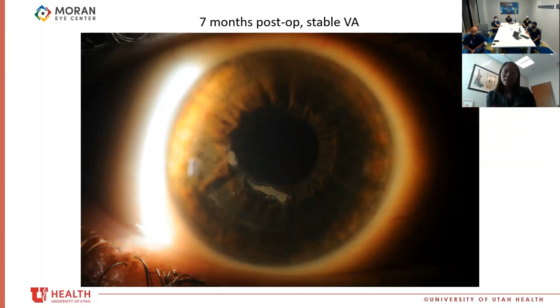I know Elio reported it several years ago. And I think in these cases, I just tell the patient, as you probably did as well, we'll see what happens and no guarantees. But sometimes it's tricky with these little areas, these nests that just get in there somehow.